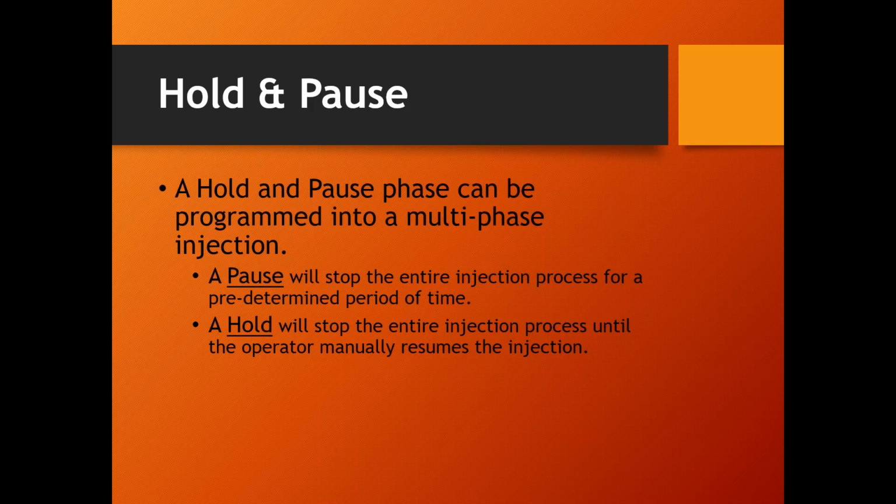Now, a hold is the same concept, but it's an indefinite stoppage. Instead of a pause, we put in a hold, and then what will happen is the injector will get to the hold phase, and it will hold, and it won't restart until the operator hits the inject switch. That is the subtle but different aspect of a hold versus a pause.